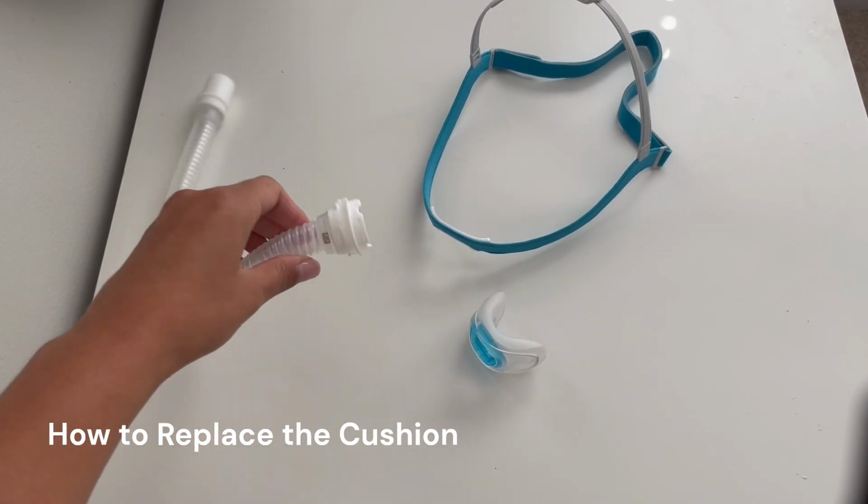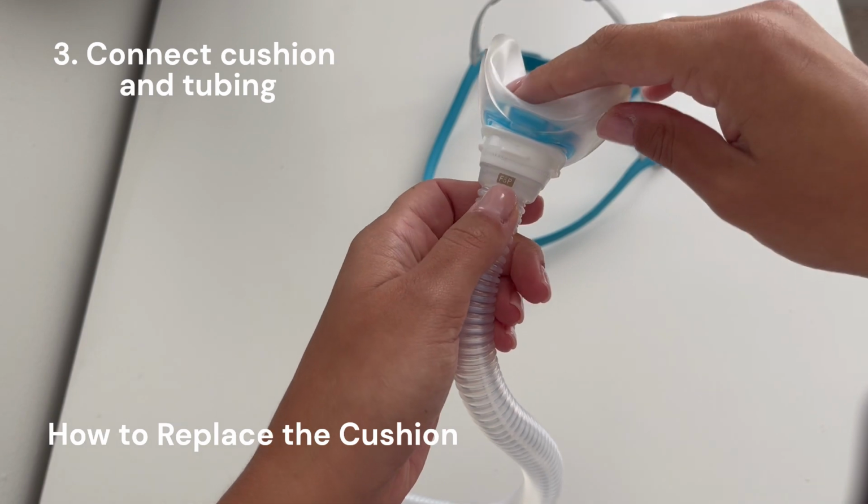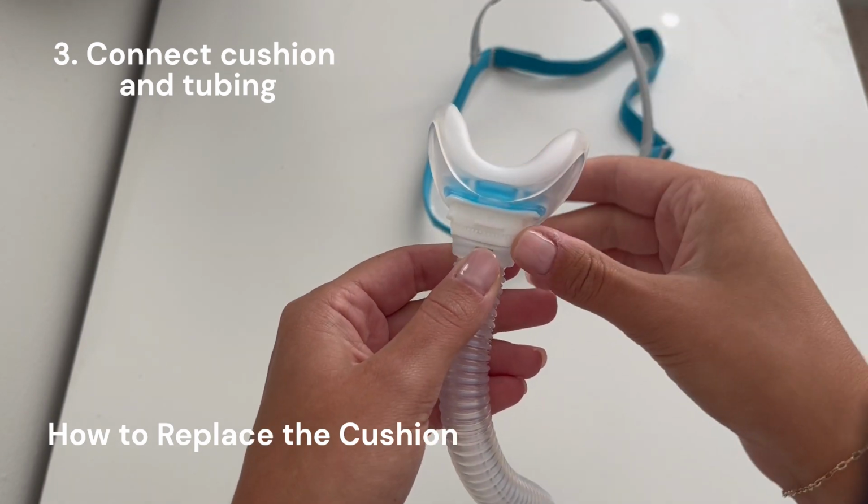Once you've cleaned or replaced your cushion, attach it back to the tubing. You will hear a soft click indicating it's properly in place.